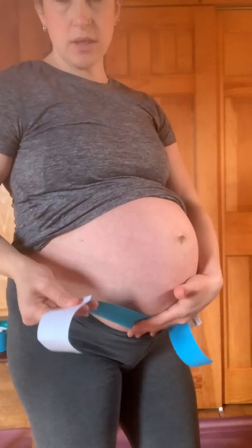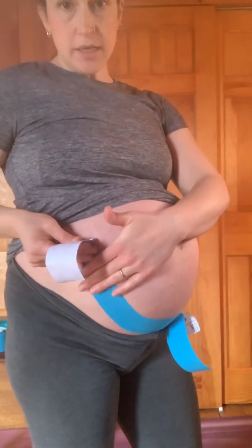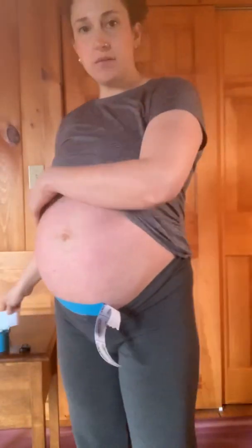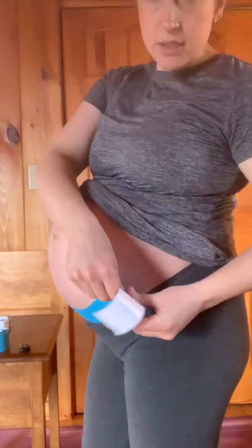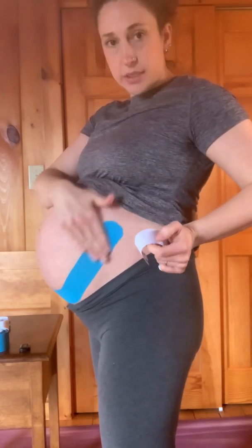Then we're going to do one side of that belly band, peeling the tape to the end while still holding on to the paper so that I'm not putting my fingers on the adhesive. Apply a nice amount of stretch up the side, and then at the very end, no tension. Make sure you lay it down nice and flat — we don't want to get any wrinkles. Then repeat the same thing on the other side with nice tension up along the other side, and then no tension on the very end.